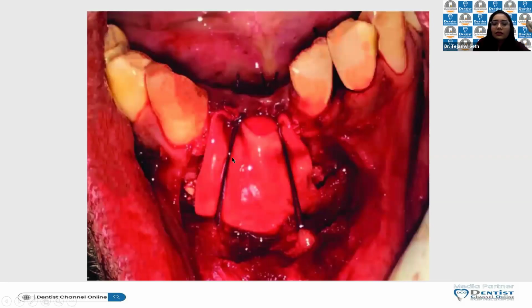If you see this, there is bone graft, there is a membrane, and this is the periosteum. So we have taken the bite from your lingual side. Then again, we have adapted it. If you can see, this side of the membrane is covering to the lingual side as well. So this complete side, we have incorporated the suture very superficially into the periosteum.